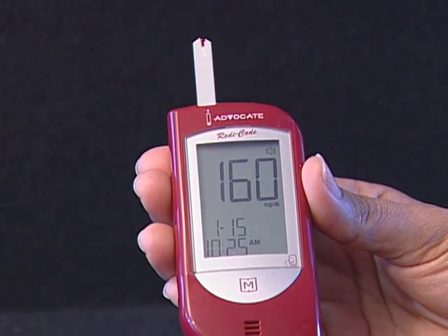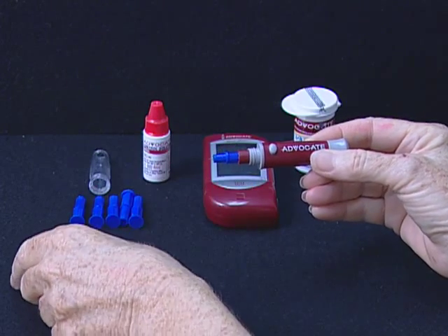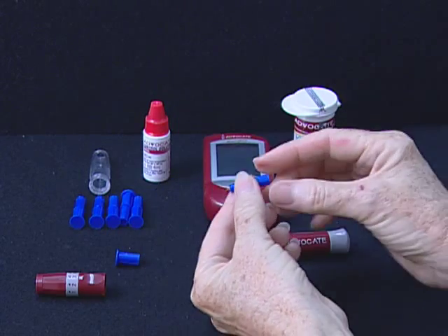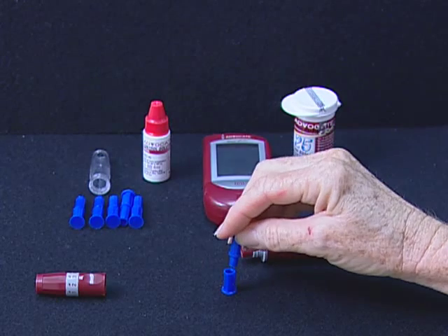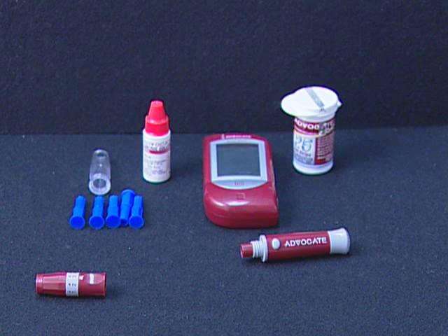Step 6: Remove the lancet. Take the lancet out carefully. Place the disc on a hard surface and push the exposed tip into the protective disc. The used lancet and the used test strip may be potential biohazards. Please discard them carefully according to your local regulations.